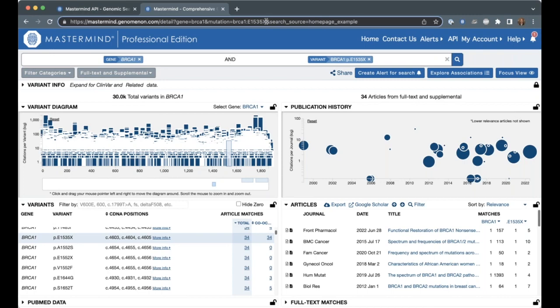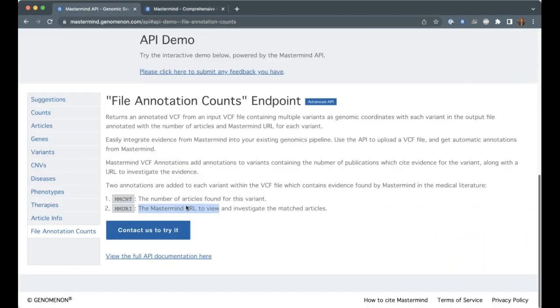All of that's going to be here in this search bar. So what we're doing is we're actually just pre-configuring that URL. So again, this covers the entire files. We have individualized endpoints for some of that higher level information, right? Dan was actually asking about therapies. So we have a therapies endpoint. I want therapies back for inserting my 2 fusion partners.